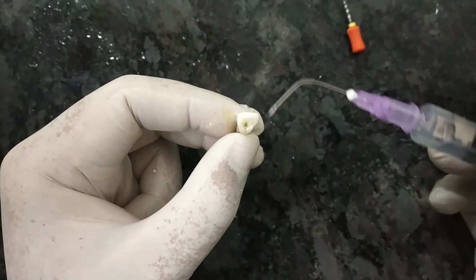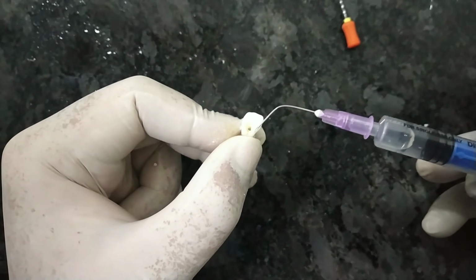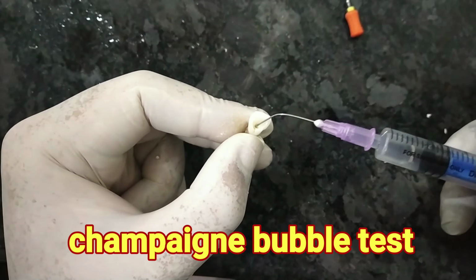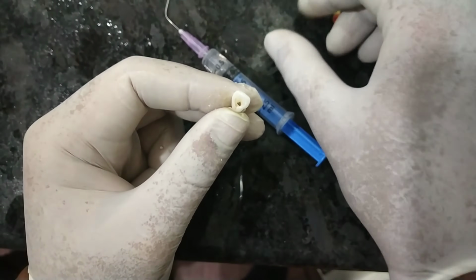So many people ask me, sir, how do we know that the canal is there or not? So what we have to do is a champagne bubble test. Just 2-3 drops of 5% sodium hypochlorite you have to put inside the opening, and you can see the bubbles coming out of it. When you see the bubbles coming out of it, that means you have found the canals.